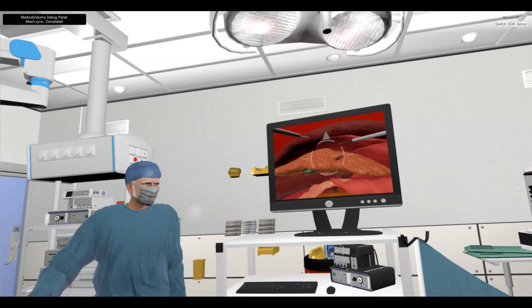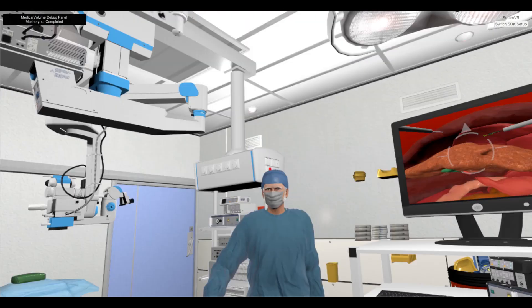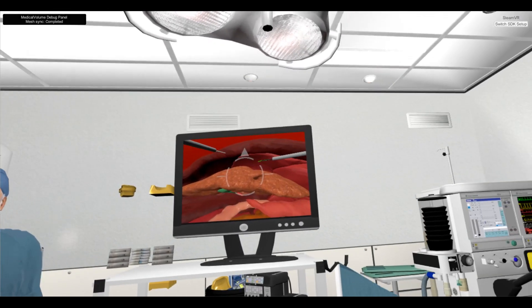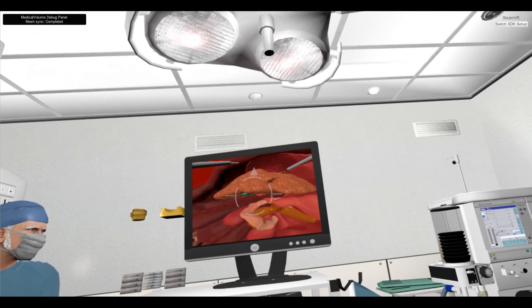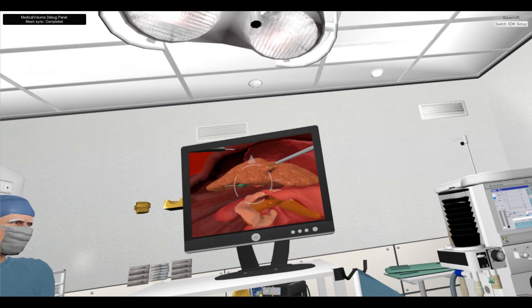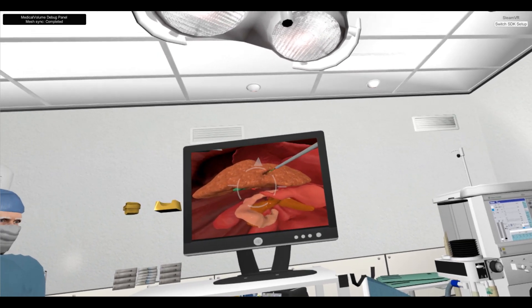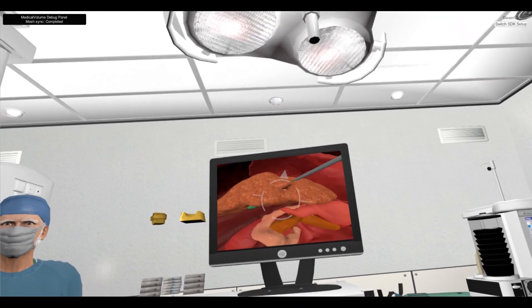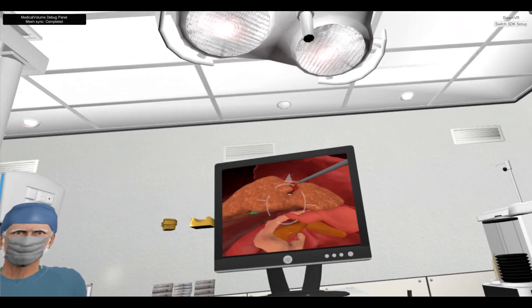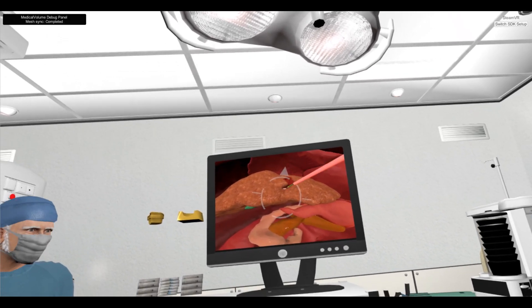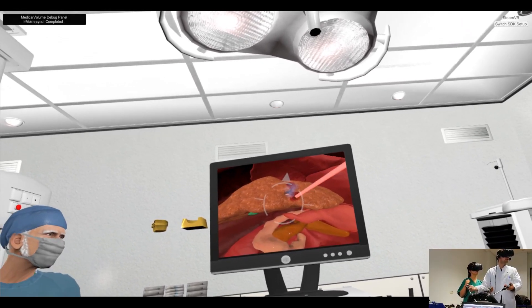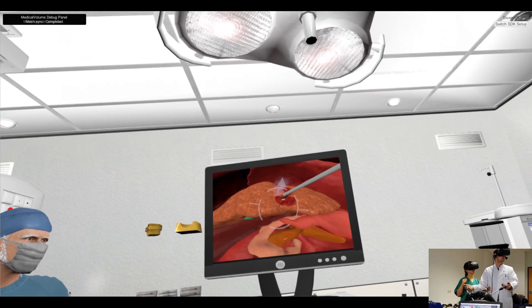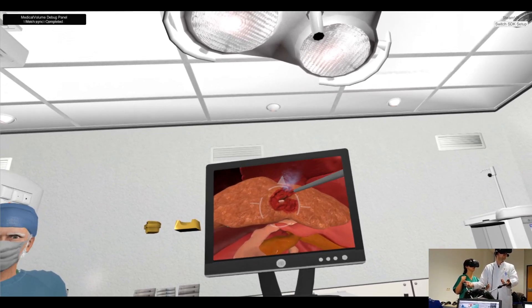In surgery mode, the experienced surgeon controls the symbol joysticks and uses the foot pedal, while the camera assistant controls only the symbol camera. The synchronization of virtual instruments over the network allows both users to see the captured view from the virtual camera, including the virtual grasper and the cutting instrument. A blue button of the foot pedal is required to press to activate the cutting.